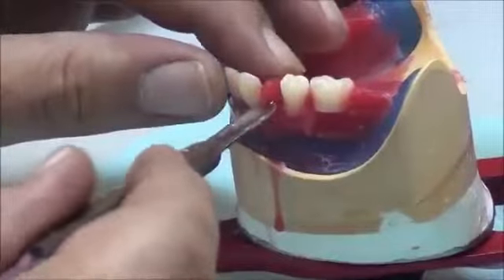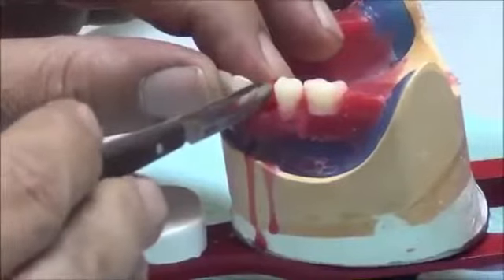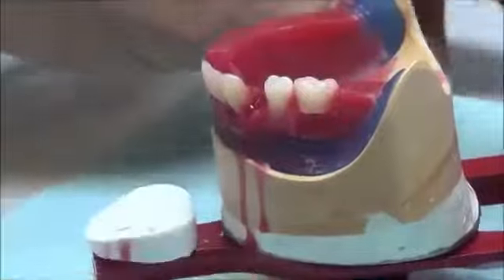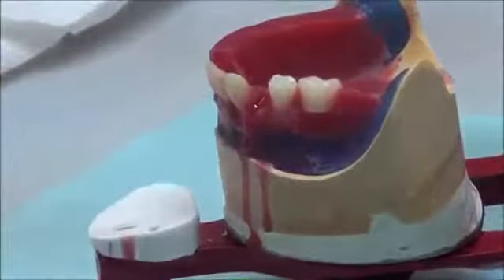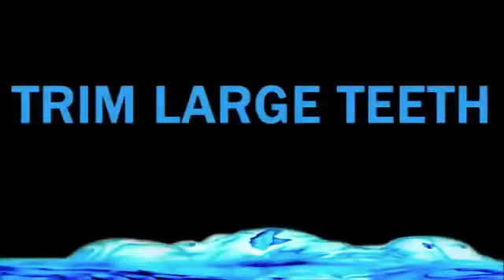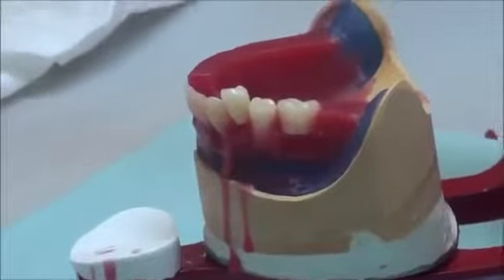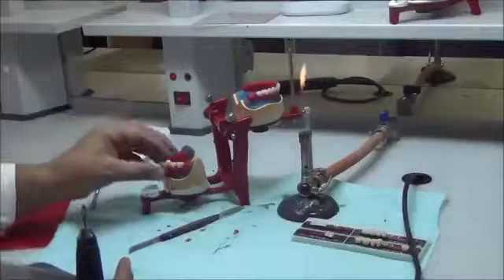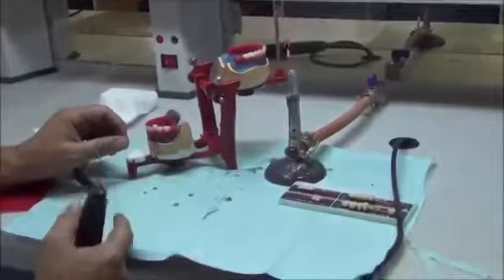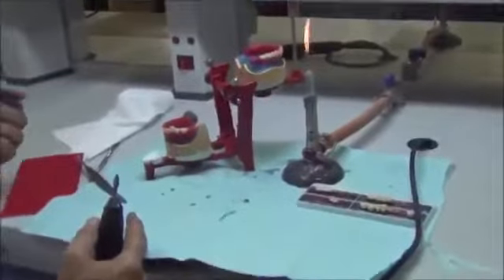First we remove the wax for tooth number 4, which is the lower premolar. And we try to put it, and we find that it doesn't have any place. So to make the tooth fit, we're going to use a handpiece. We're going to trim using the tungsten carbide bur, and we have adjusted the speed of the unit at 20. We don't want a high speed because we don't want the tooth falling off while trimming.